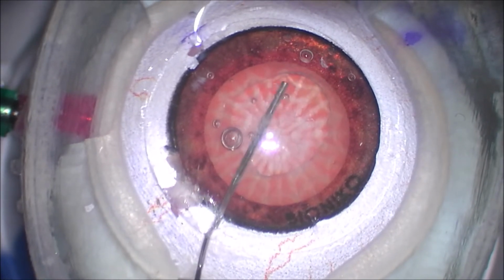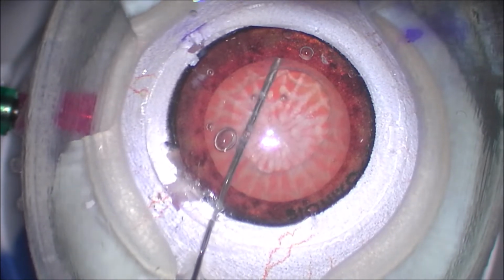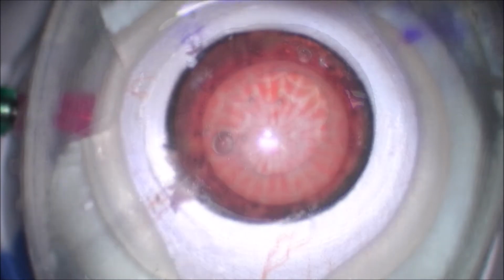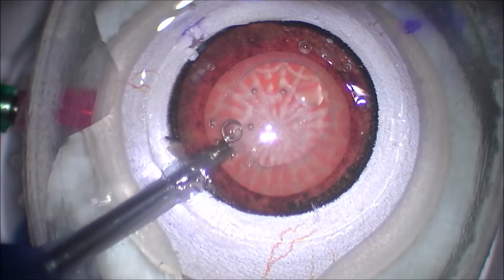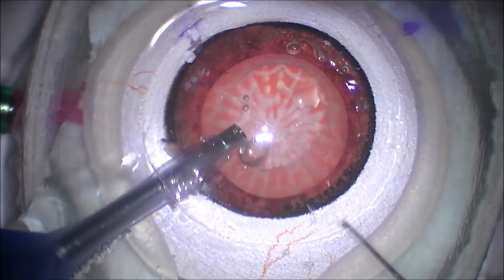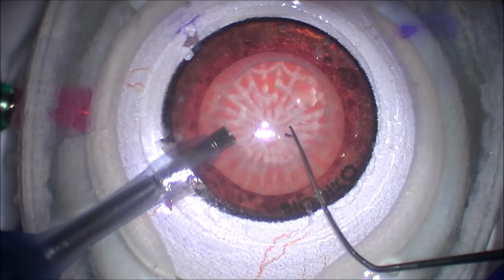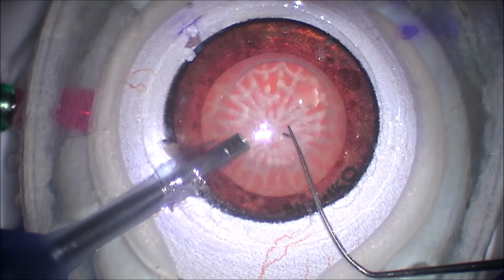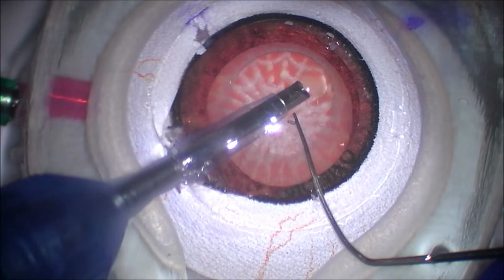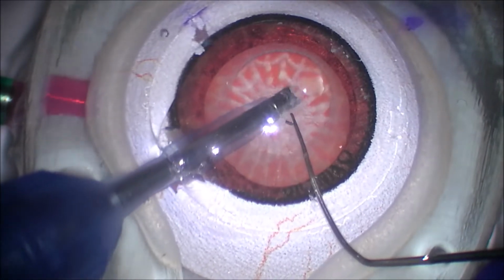You can see she's got a nice rexis opening. Again, she made those incisions as well. And using the ink pen to mark the limbus, I think, is quite helpful with this model. By doing it this way, you have a much better understanding where your incision is. Of course, in a real human, when you make incisions, you can see a little bit of heme. You can see a little bit of change in the wound there. Of course, you don't have that with an artificial eye, and so marking it with the ink pen is quite helpful. And so now she's beveled up and she's starting to sculpt a trough.